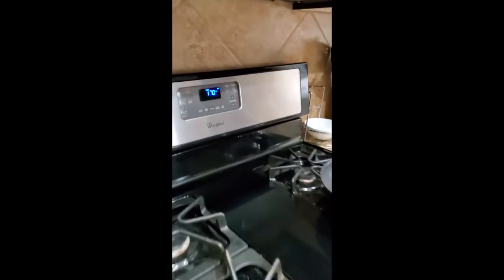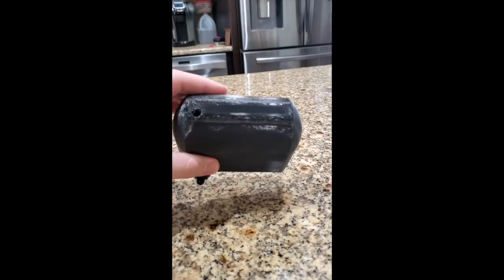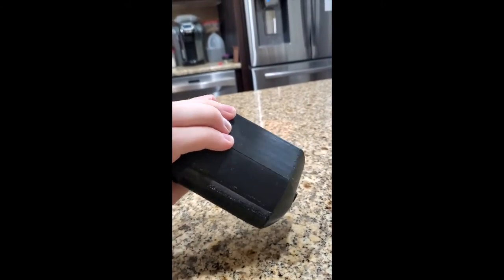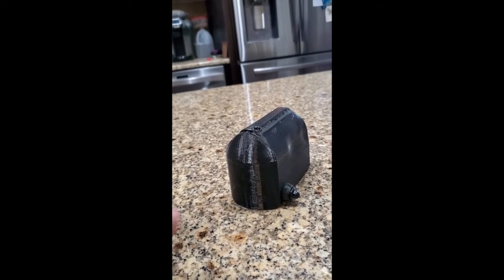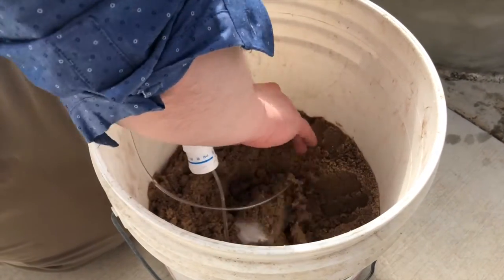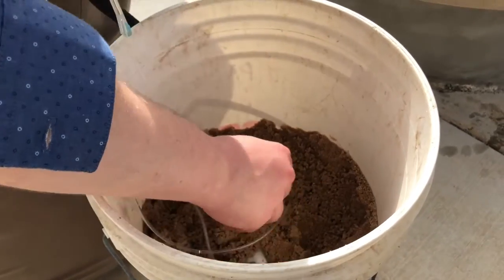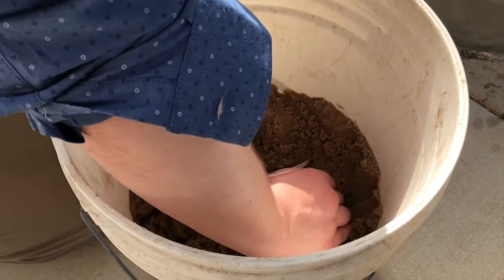Direct exposure to temperatures above 50 degrees Celsius produced slight deformation but had no effect on performance. After the temperature tests, the device still functioned normally and could detect a lack of flow. The PIVP can resist soil sizes down to about half a millimeter in diameter without significant contamination. Here we see the device fully covered in sand and fully functioning after it is taken out.